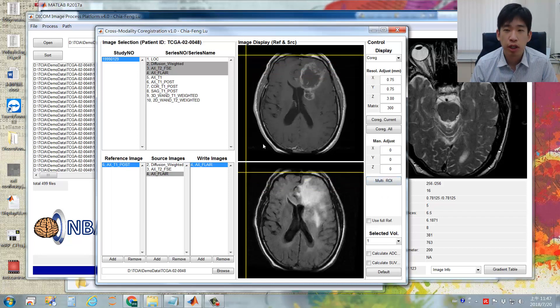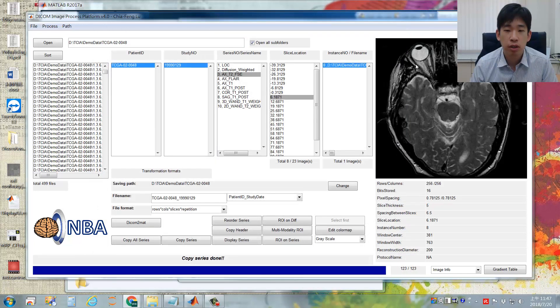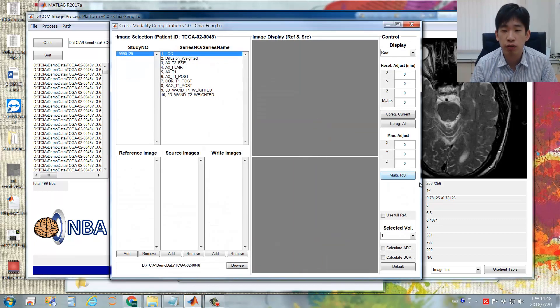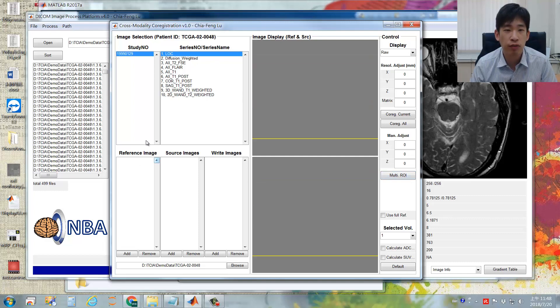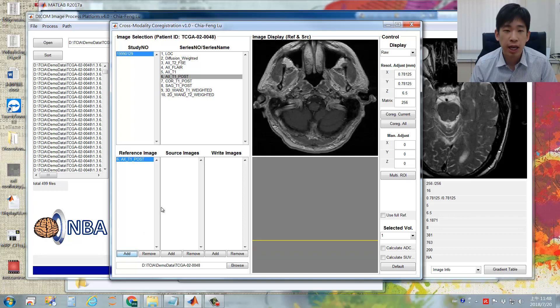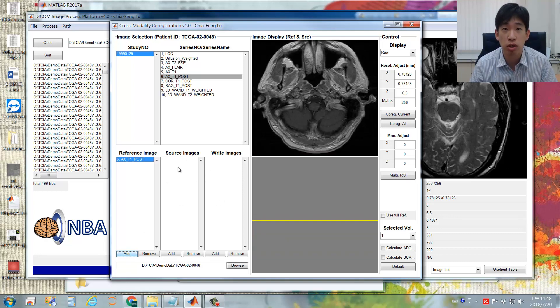For example, if I close this image co-registration figure and click the multimodality ROI button again in the main window, the mandatory step you need to do before clicking this button is to assign one specific reference image. We use the post-contrast T1-weighted imaging as the reference image. In this step, you don't need to reassign the source images again.